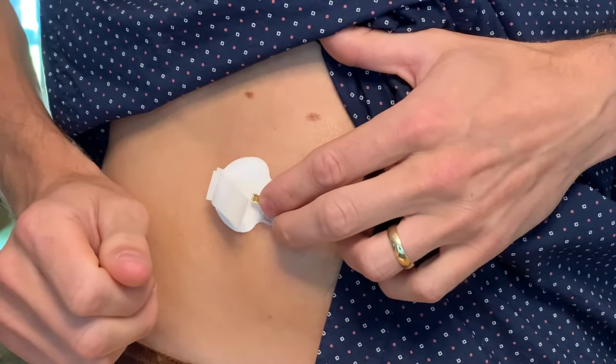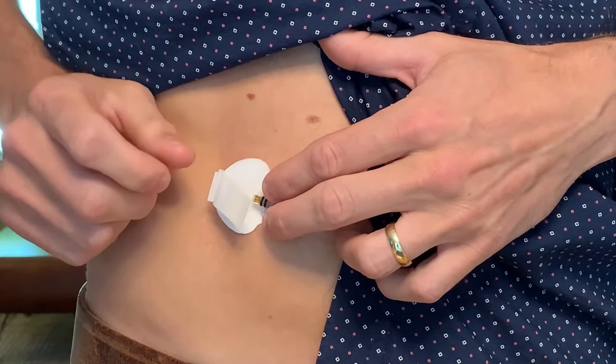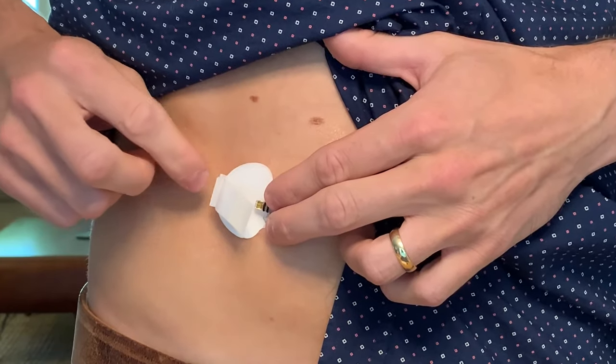Now I'm going to take off the paper liner from the sensor adhesive pad and press firmly to make sure the sensor remains attached to the skin, like this.